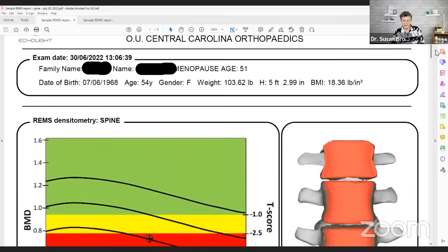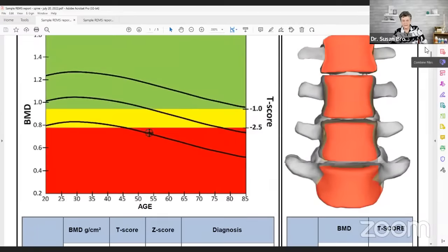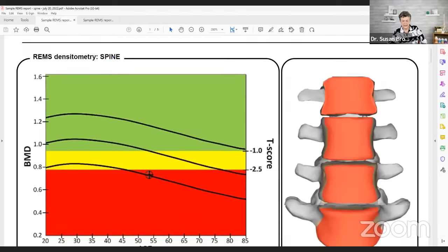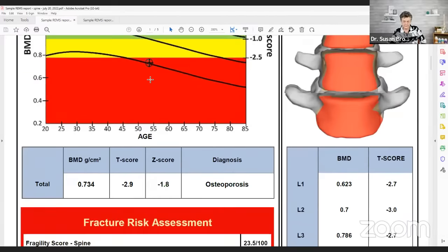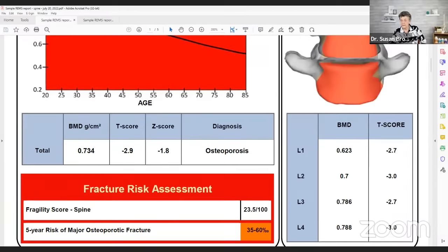This is the REMS of the spine from Central Carolina Orthopedics. You'll notice this scale is the T-score — just like the DEXA. The red indicates a lower bone density score in the osteoporotic range, the yellow is osteopenia, and the green is normal bone. You can also see an image of the spinal reconstruction from when the echo waves come back. It also measures the four lumbar vertebral bodies and gives a T-score for each one, along with a Z-score.